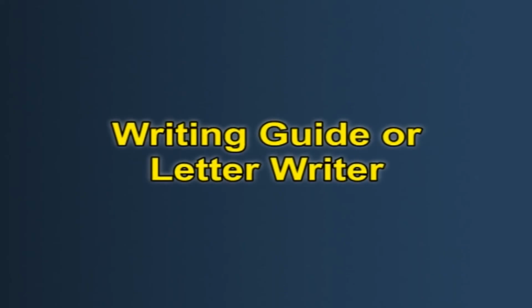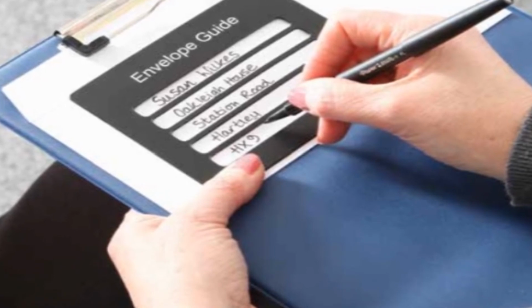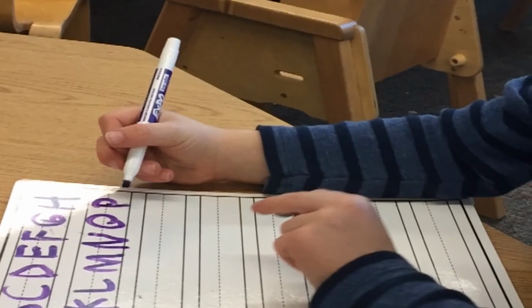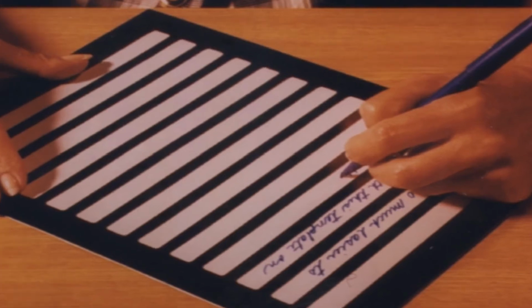The next device is the writing guide or letter writer. The writing guide or letter writer is like a folder with rectangular slits. A sheet of paper is placed inside it for writing. It helps the person with low vision to write in straight lines without any glare. Even children with normal vision who have problems in writing in a straight line can use this for training purposes.